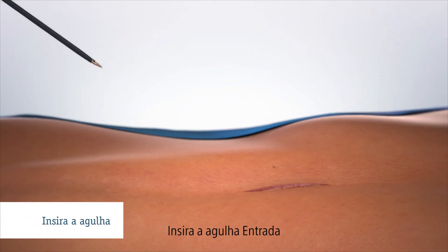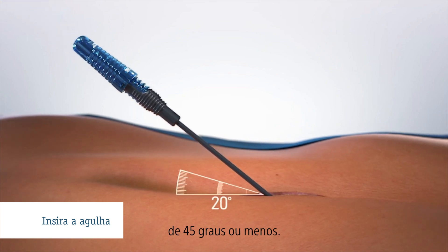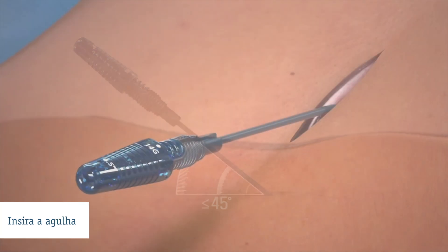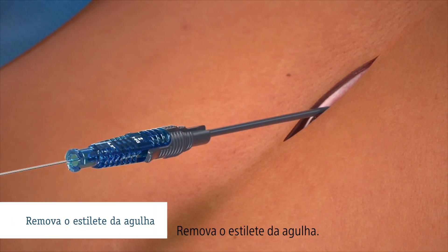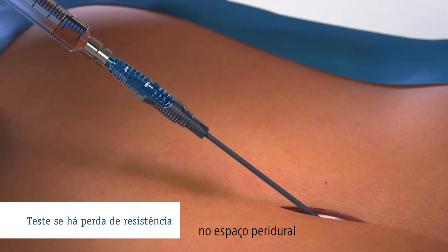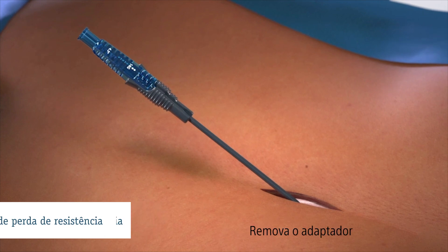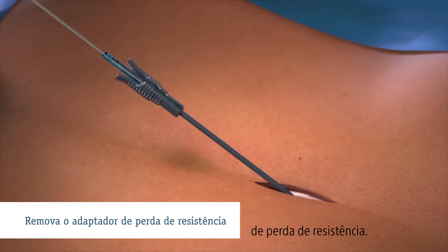Insert the Entrada needle into the epidural space using an angle of 45 degrees or less. Remove the needle stylet. Verify entry into the epidural space using the standard loss of resistance technique. Remove the loss of resistance adapter.